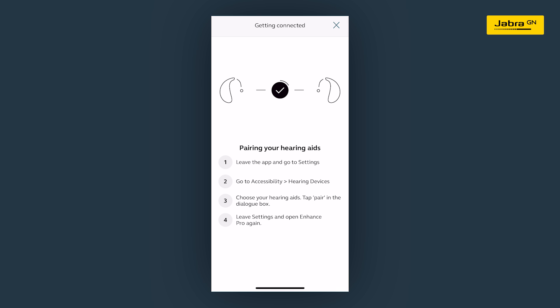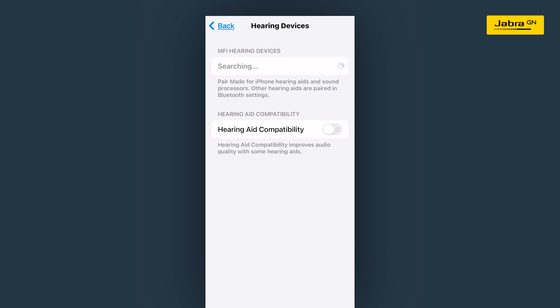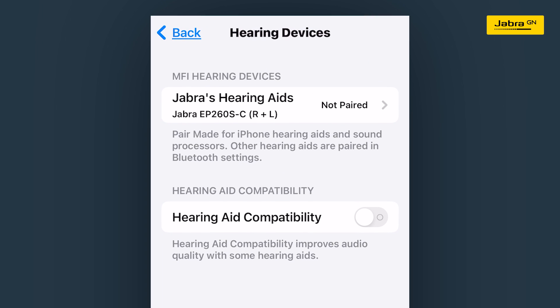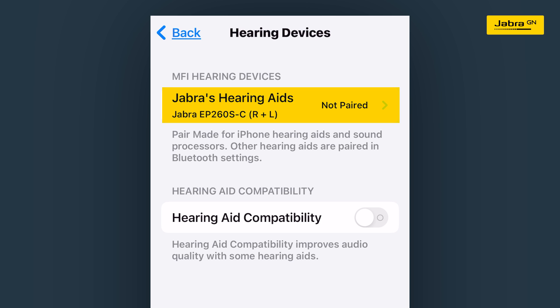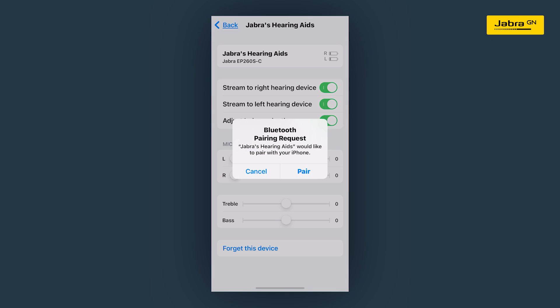Your iPhone will now request to pair the hearing aids. On the top of the screen, under MFI Hearing Devices, your hearing aids will appear as detected devices and they will show as not paired. Tap the hearing aid name to pair your hearing aids. You will see a pop-up box requesting you to pair your hearing aids with your iPhone. The alert will appear once for each hearing aid, so tap pair twice.